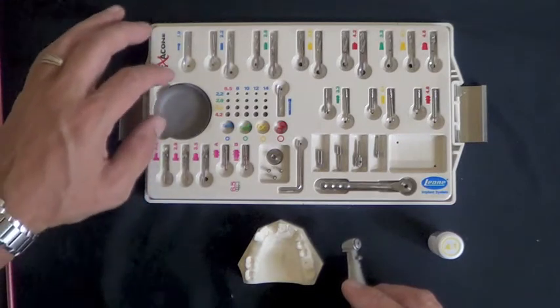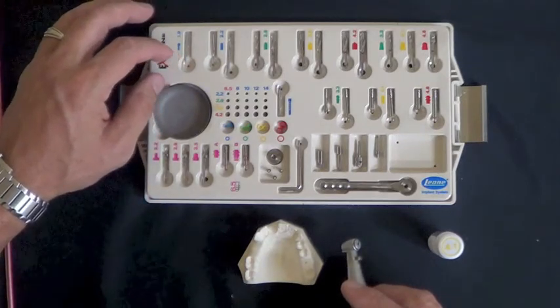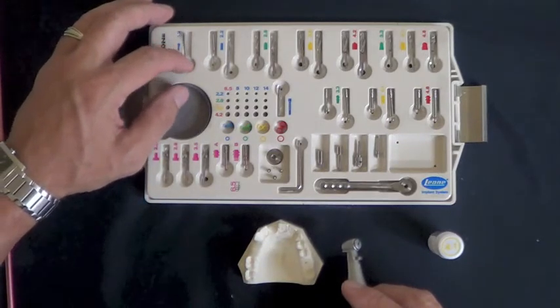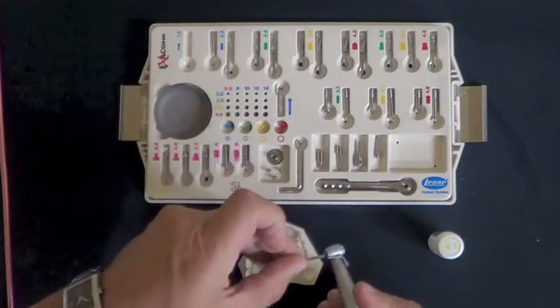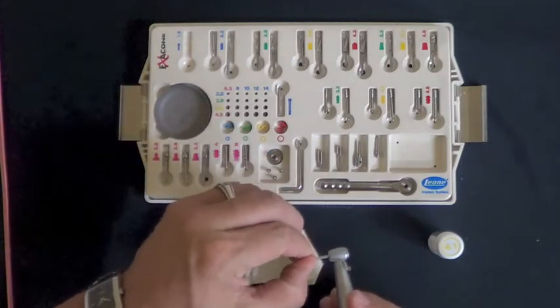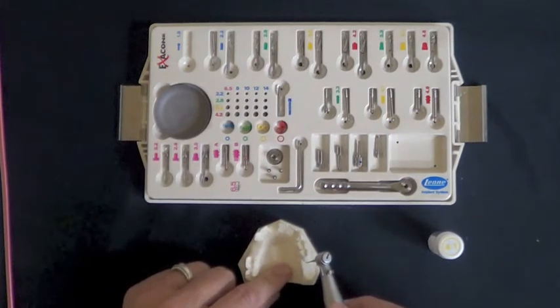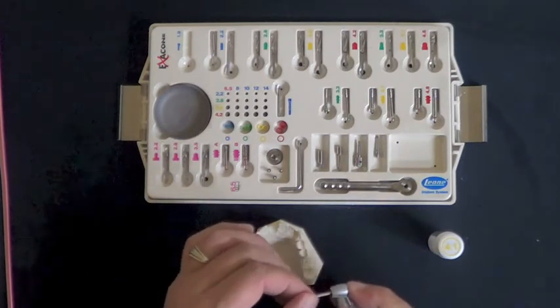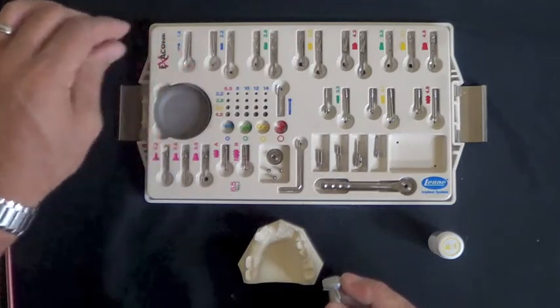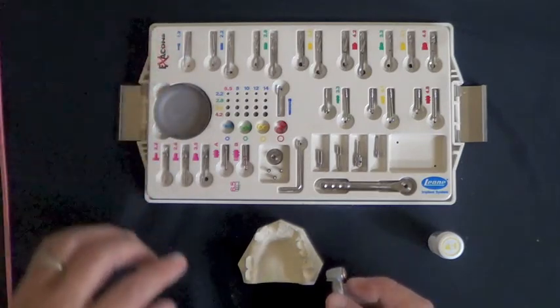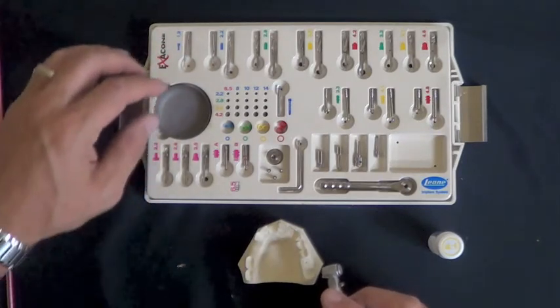Generally looking at the Leone Surgical Kit, we would normally start in a non-guided surgical placement by using the round burr in a surgical handpiece, running at about 1,200 to 2,000 RPMs. Make a purchase where you'd like to place the implant with the round burr.